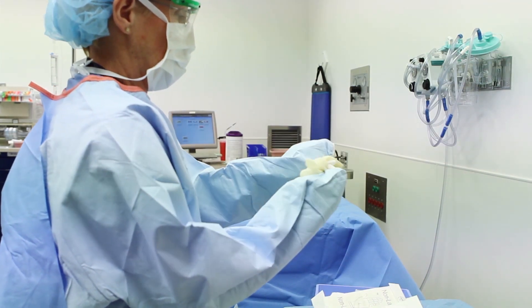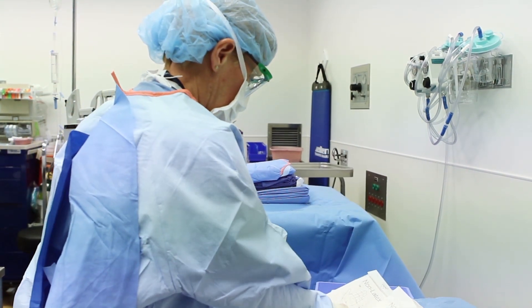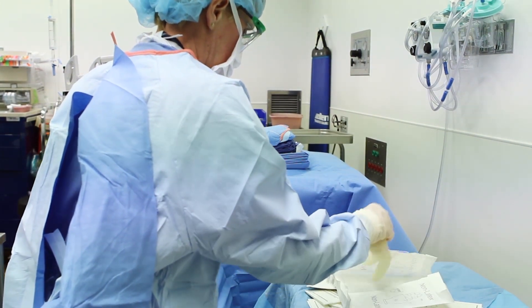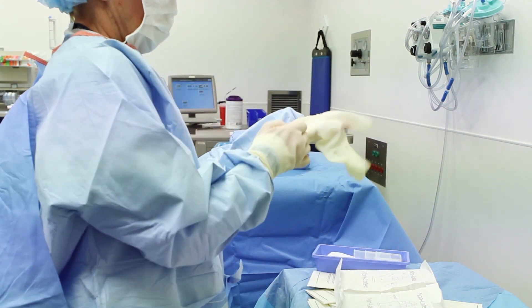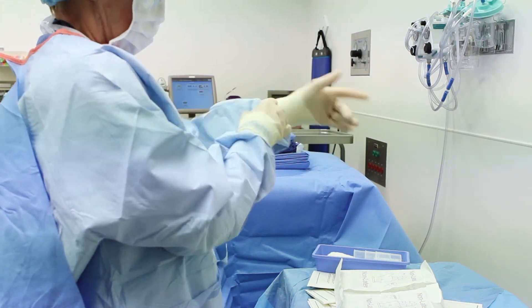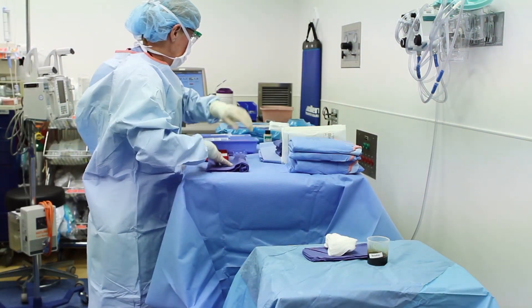We will first demonstrate how to put the surgical glove on without requiring any assistance. After placing the gown on sterilely, the hands remain inside the gown, leaving the cuff of the gown covering the hands. The glove is then placed over the gown and the hand is brought through the glove without exposing the outside of the glove to the skin of the hand. This process is then repeated on the opposite hand. Once completely gowned and gloved, preparation for surgery can be performed in a sterile manner.